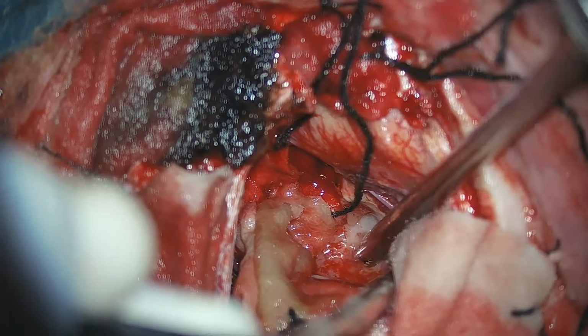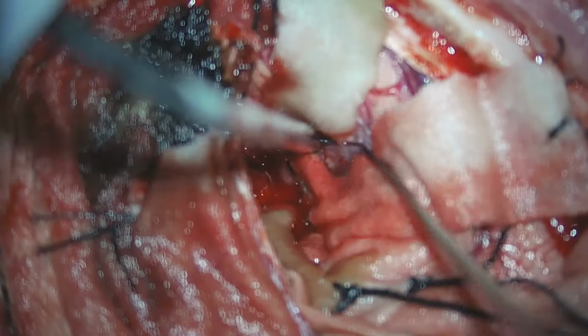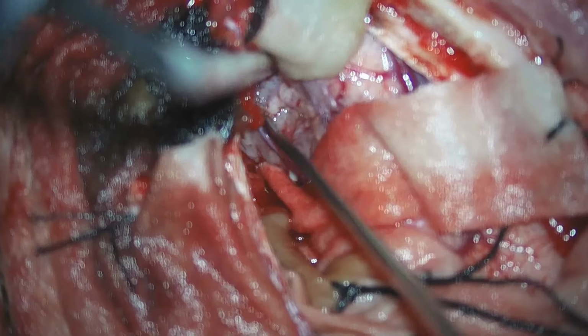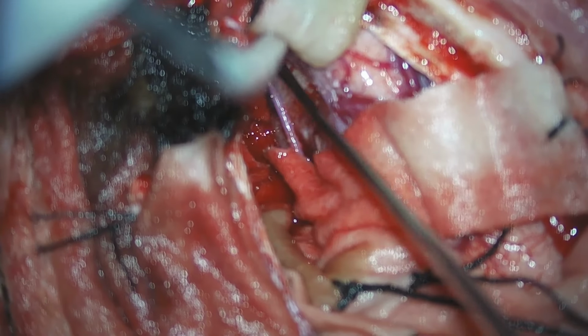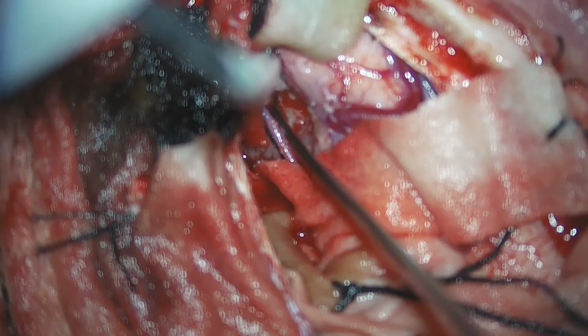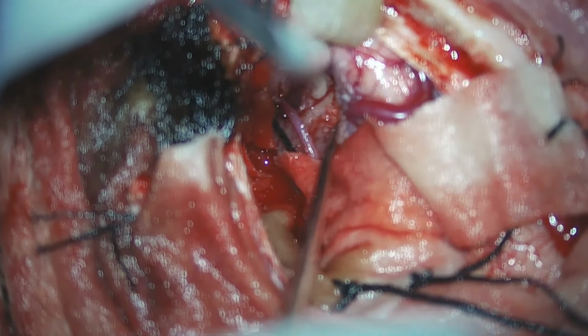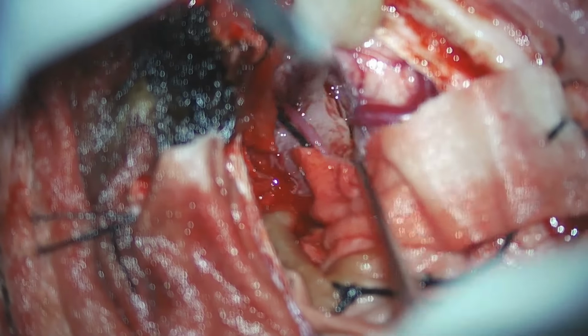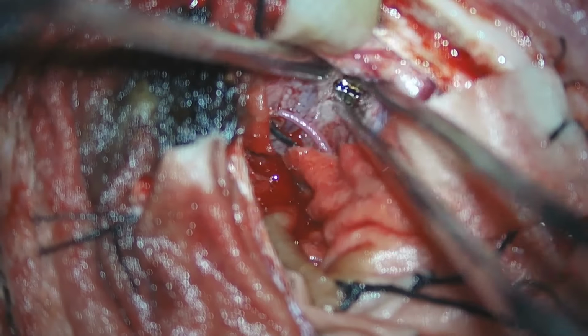We are debulking the central part of the tumor here, and once that is achieved, we have moved to the upper pole of the tumor, anterior aspect, and we are trying to create a plane between the normal brain and the tumor tissue. In all these steps, we can see the cortical vein is being held intact without any damage, and this has to be done slowly.